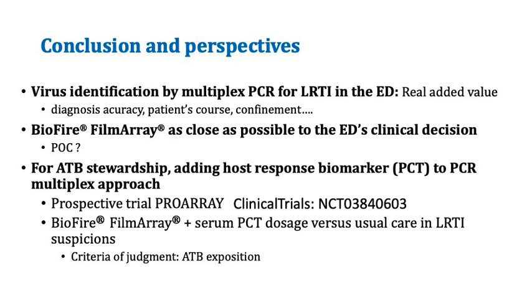We need to have the confirmation of the virus infection very quickly. It is clearly a question to settle about point of care for this kind of device, because if we are logical, we want to have the virus result as close as possible to the ED's clinical decision.